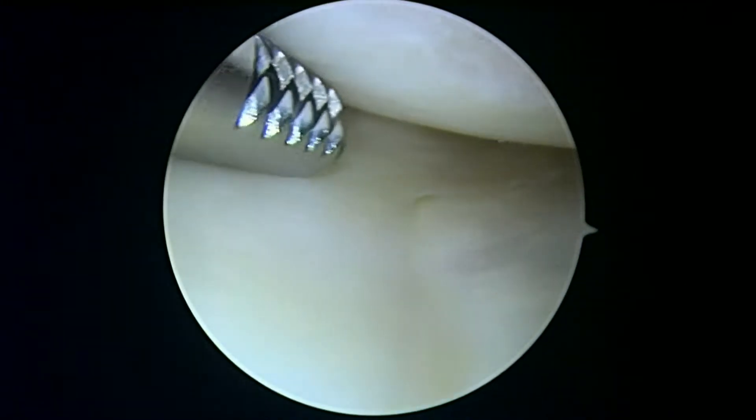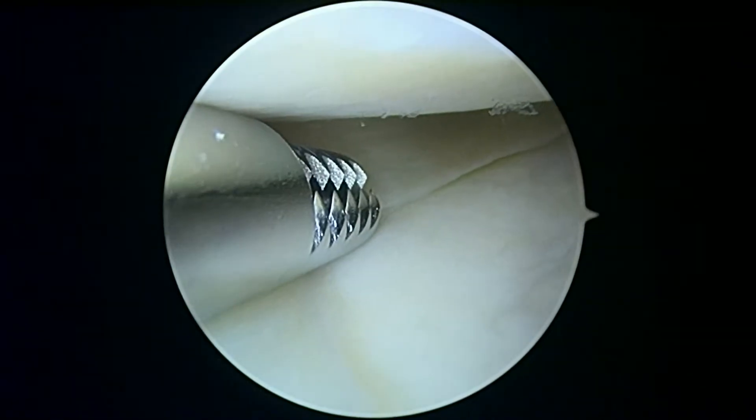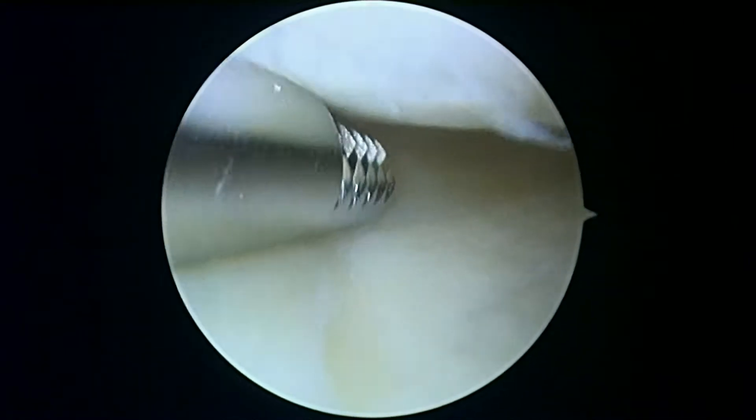As we get to the meniscus, this is really the anterior horn of the medial meniscus — this looks pretty good. As we come around to the body, this looks pretty good too. Hold the camera there. I'm going to straighten your knee and try to get a better look at the posterior horn here.